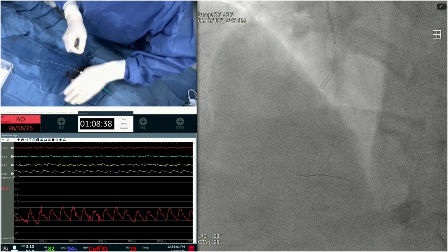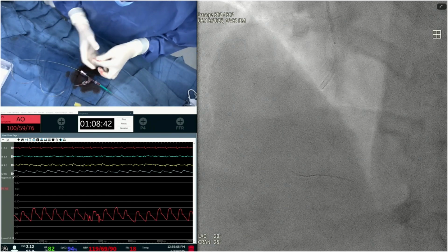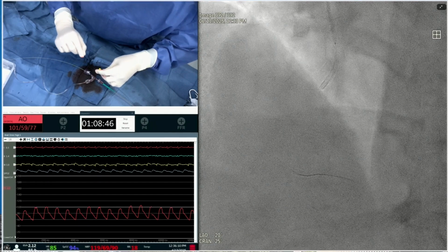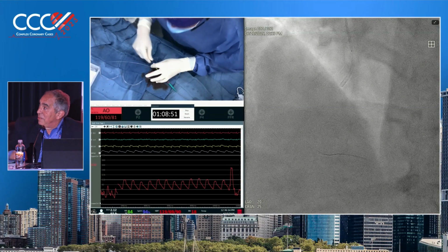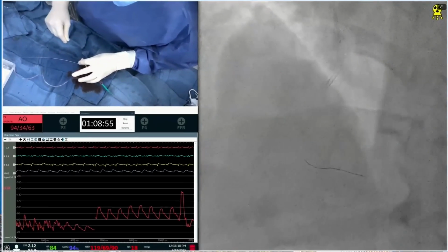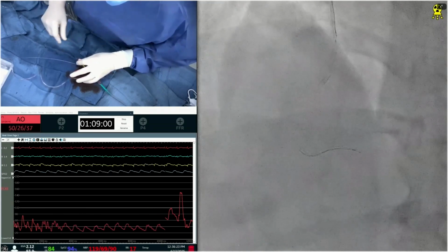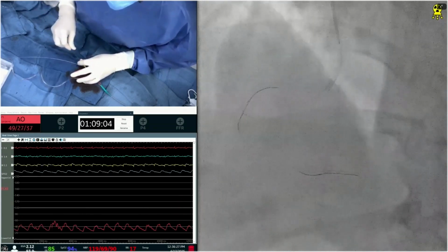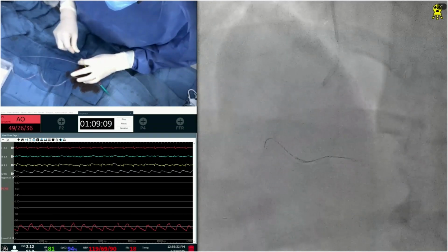And I think from an operating standpoint, we're so glad we have all these atherectomy options, IVLs, great hemodynamic support. But from a practical standpoint, the thing that's made the greatest benefit is a guide extender. Yeah, no question about it. If you ask what has been the discovery of the century in the last 10 years, not any of those stents or atherectomies. Atherectomy already had been done, but I would say the guide extender made our life so easy.